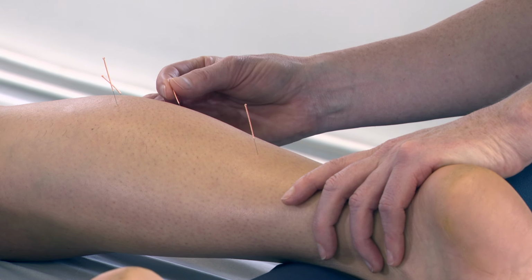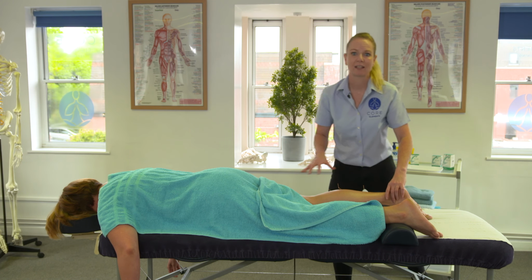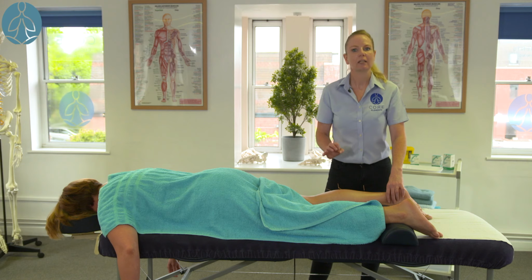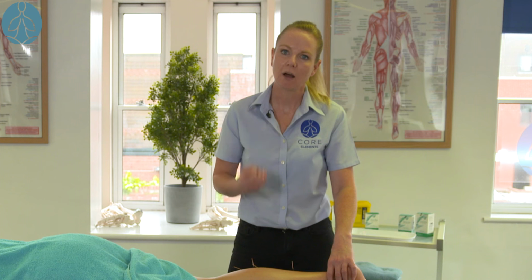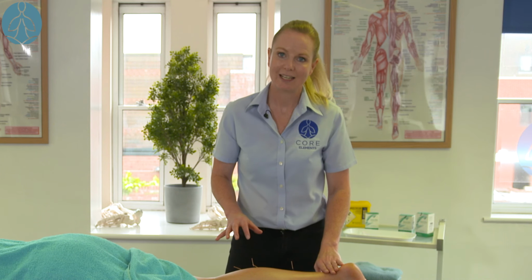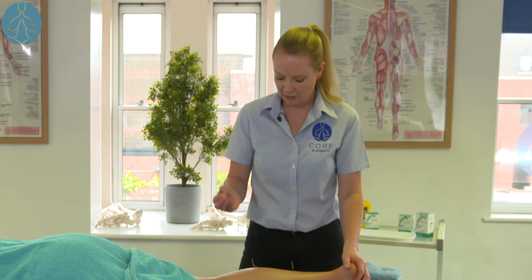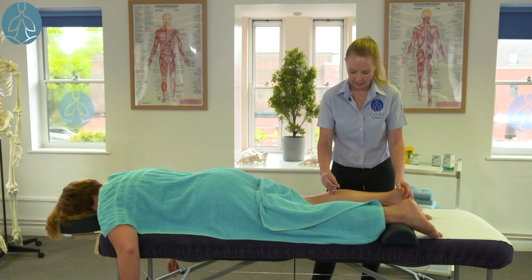And although we've got four needles in the calf region, this is going to help to stimulate a relaxation effect in all of the area. So this is our dry needling technique, inserting the needle into the gastrocnemius and the soleus area of the calf region. Useful, as I mentioned, for cramping, but also for reducing hypertonicity in the muscle tissue, especially helping with conditions such as Achilles tendonitis or Achilles tendon strain and plantar fasciitis as well, which may have resulted because of tension in this calf area. And the stimulation techniques that we did were the flicking technique, the turning technique, and the peppering technique too.